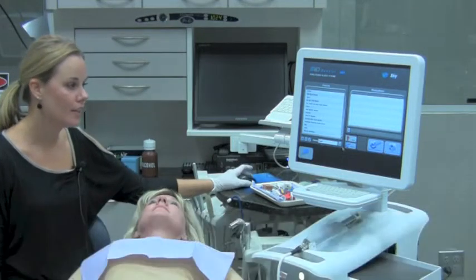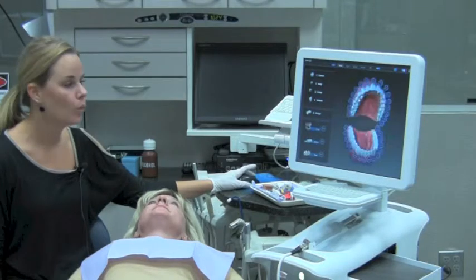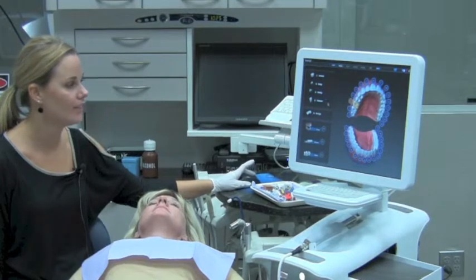I've entered Terry as a patient of record. Now what we're going to do is start a new restoration for Terry. We're going to be scanning tooth number three — it is a crown. We also have the option of an inlay, onlay, veneer, and a bridge.